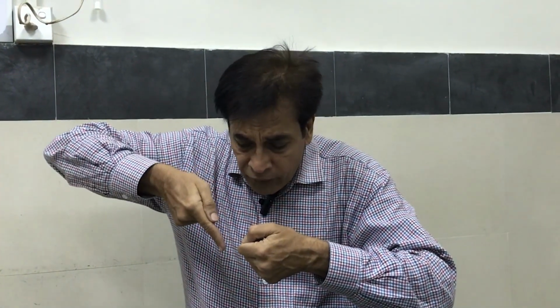Okay, so you will appreciate the fold where the tonsil is attached, and then you will take a surgical blade or the tip of a diathermy in your right hand, and then you will make a very superficial incision with the help of a blade. Normally a number 12 size blade is used. You can also use a number 11 blade as well, but you should not use big blades because you will have to incise only the mucosa.